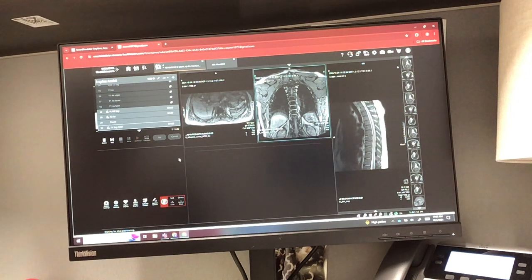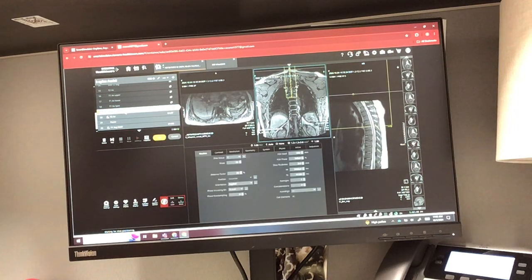So I would have done the coronal localizer, the T2 sag. Now I'm setting up my FLAIR sag. Well, I already did a T2 sag, so I know that my parameters are all going to be identical. They're going to match, okay? My field of view, slice thickness, gap. The only thing that's going to be different is my FLAIR sagittal.